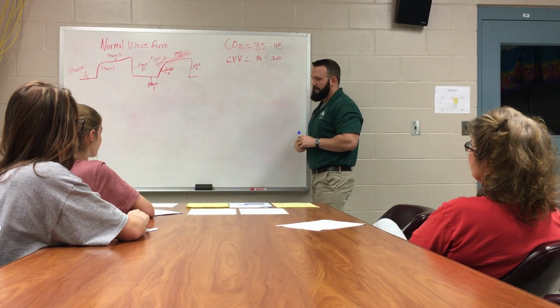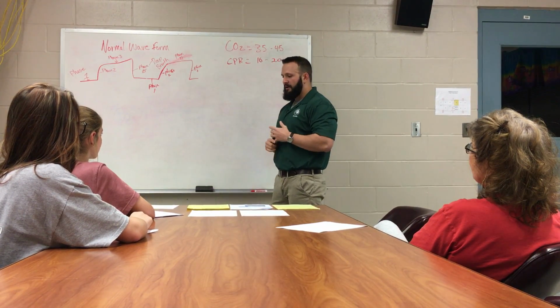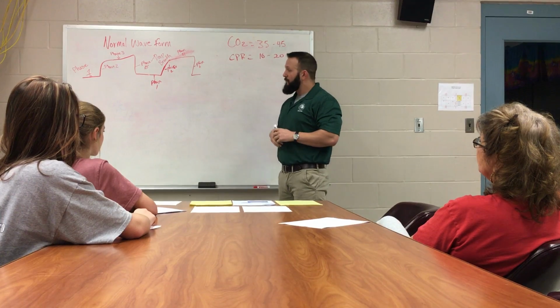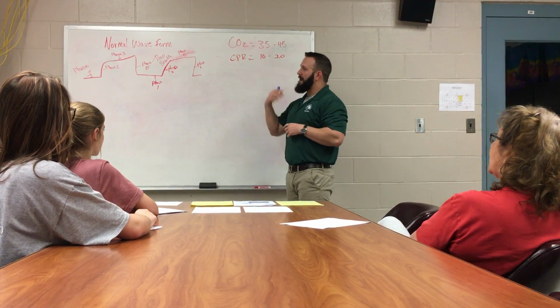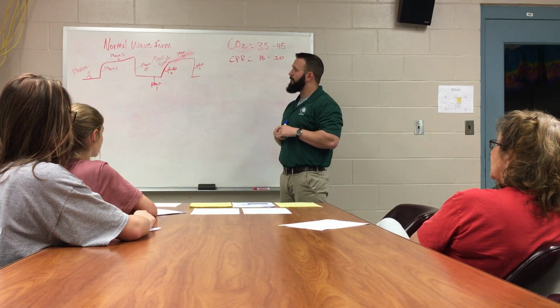So let's talk about a few things. So now I know that CO2 is my byproduct of oxygen exchange. I know that I've got some ways of monitoring. So how can this benefit me as a nurse? So the greatest thing about it, I'm the patient that came in, you've put me on a nasal cannula, and now you see a waveform. Well, how can this help me as a nurse? I need to be able to understand this waveform, so let's talk about it.